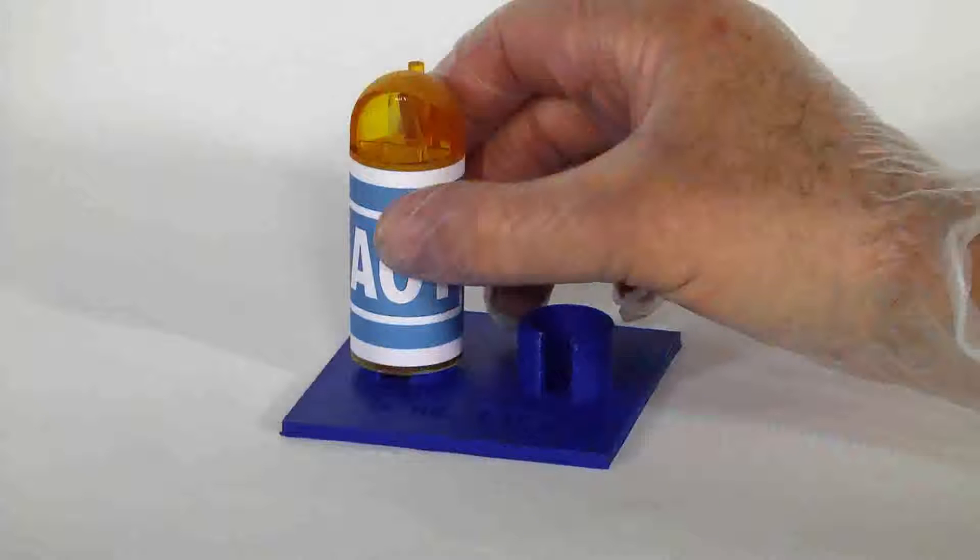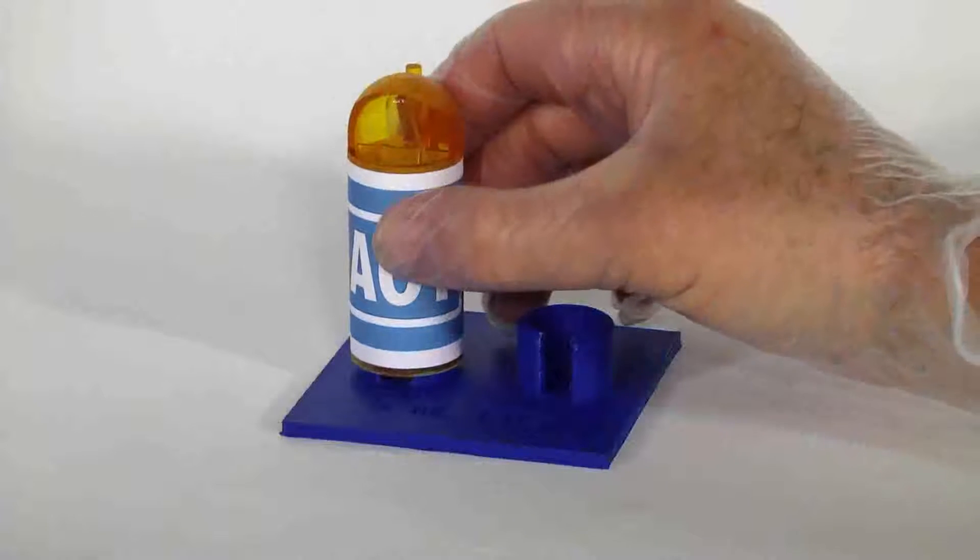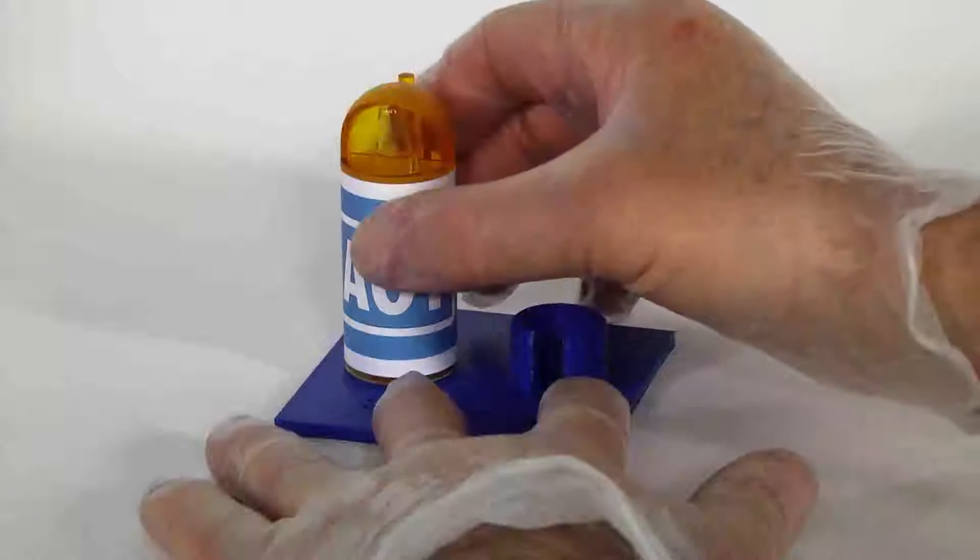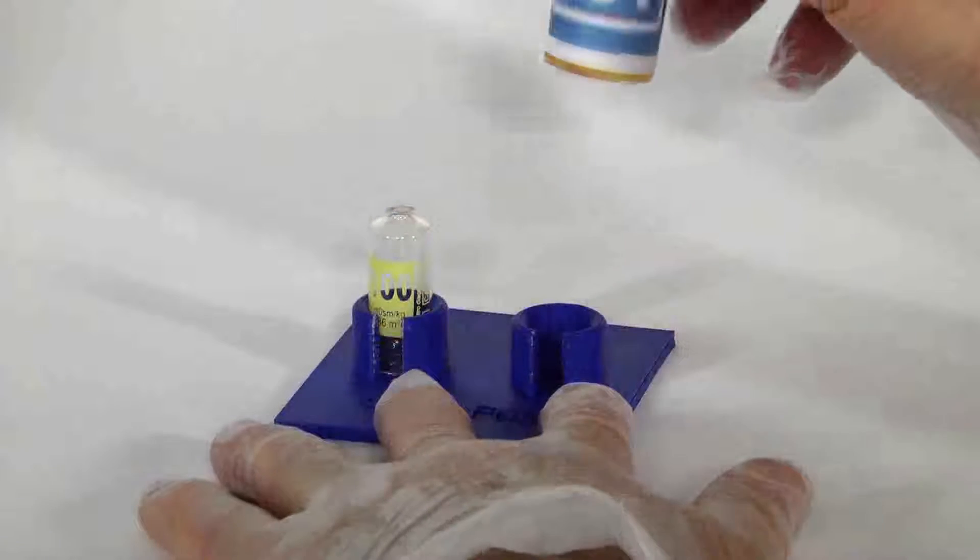Then apply slight to firm pressure until you hear a snap. Lift the opener straight up and the ampule will be open with a clean break and the neck is caught in the top of the opener.